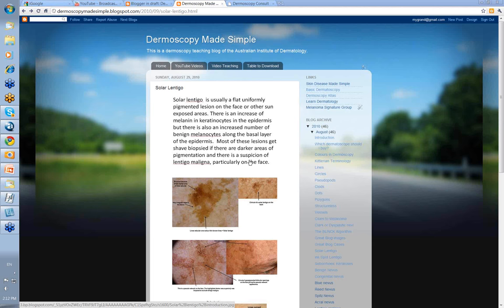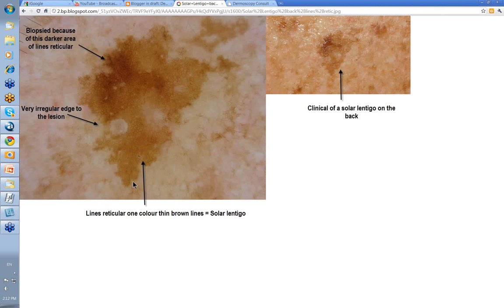Most of these lesions will be shave biopsied if there's a darker area of pigmentation within a lesion, especially on the face where lentigo maligna is your differential diagnosis. That's the big one you're really trying to exclude when looking at a pigmented lesion on the face — is it a solar lentigo or is it a lentigo maligna? The more variation in color there is clinically, the more likely it is to be a lentigo maligna.